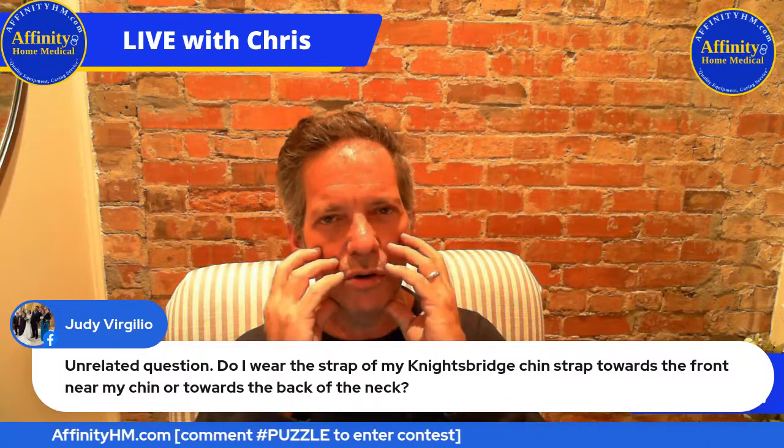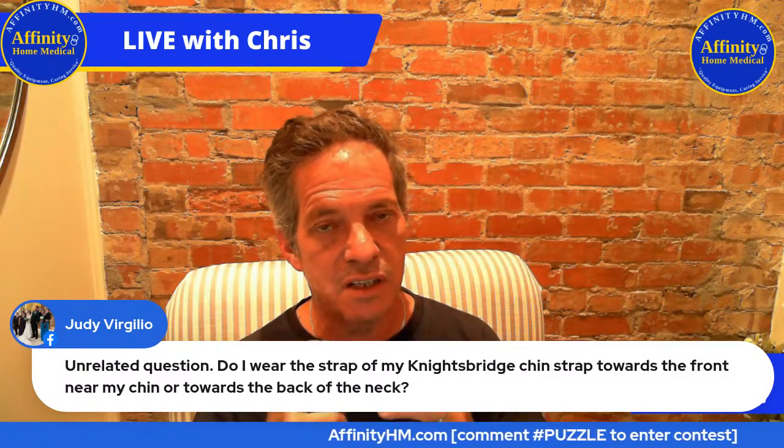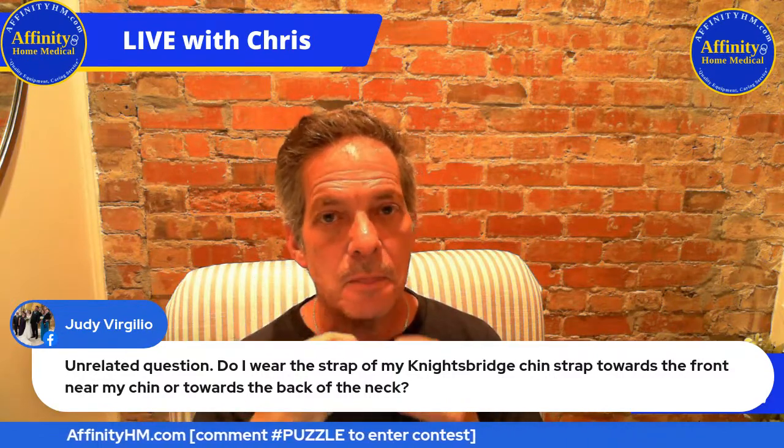Comfort is important though. And also with all chin straps, careful not to make them too tight, because all you really need to do is just keep your teeth together and suction the air out of your mouth, like swallow the little bit of air that stays in, put your tongue to the roof of your mouth. That also will provide an uplift to try to keep that chin up. But hopefully that answers your question there.